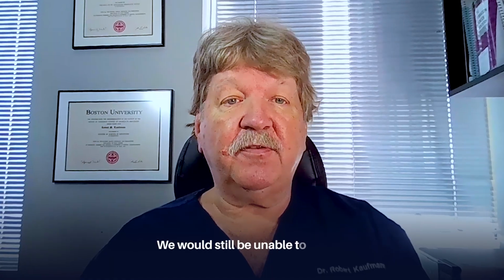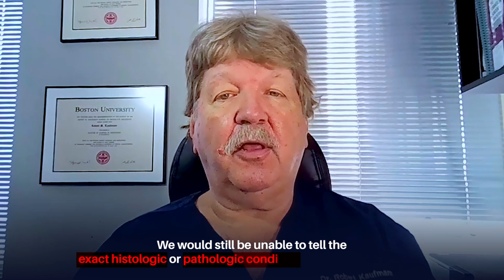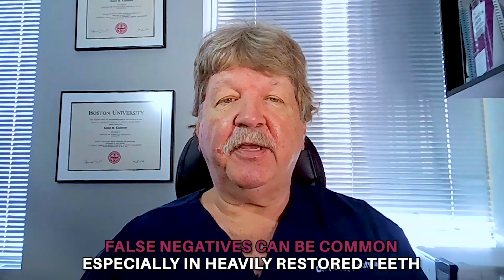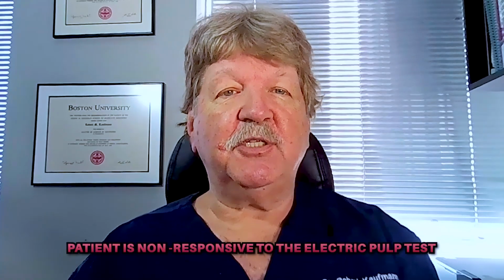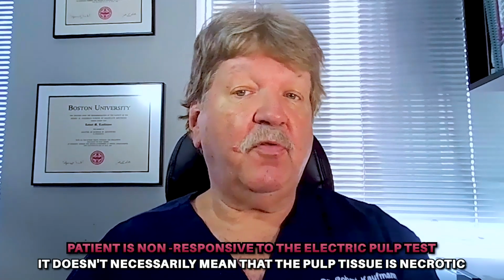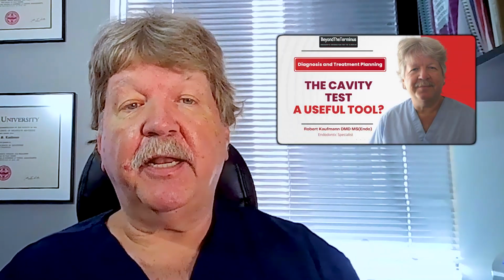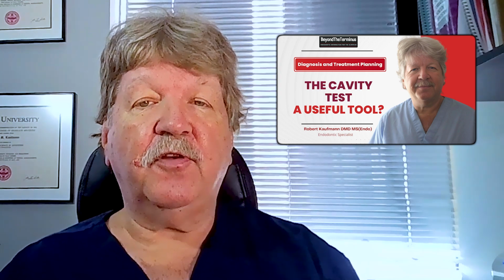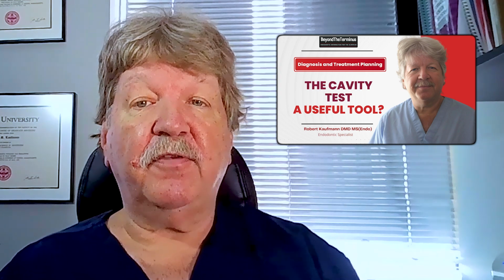We would still be unable to tell the exact histologic or pathologic condition of the pulp by the test, and false negatives can be common, especially in heavily restored teeth. Just because the patient is non-responsive to the electric pulp test doesn't necessarily mean that the pulp tissue is necrotic. At that point, we have to fall back on the old gold standard, a cavity test. If you want to learn more about that and how I do a cavity test, please check out my other Beyond the Terminus video that addresses this specifically.